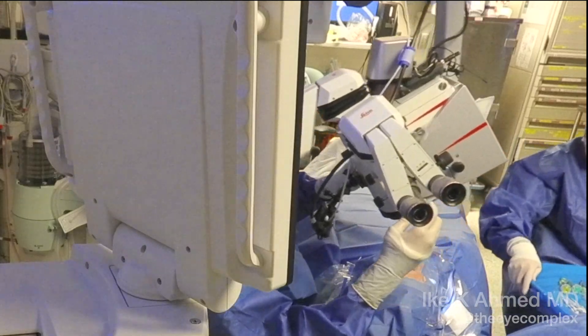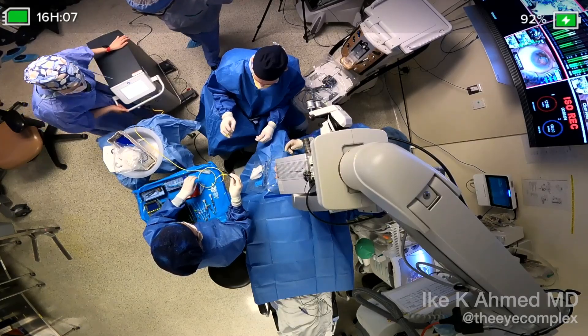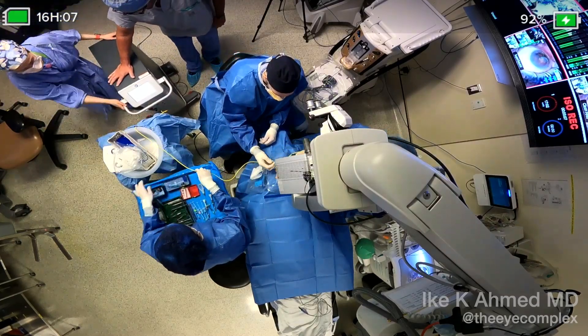This provides for an optimal view with a gonial prism, some viscoelastic on the cornea, and we now see the probe handed off to the surgeon connected to the excimer laser unit.